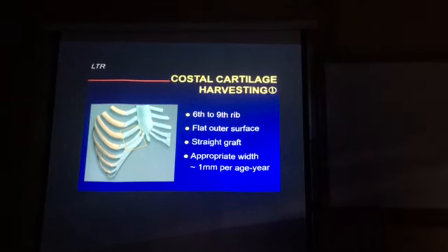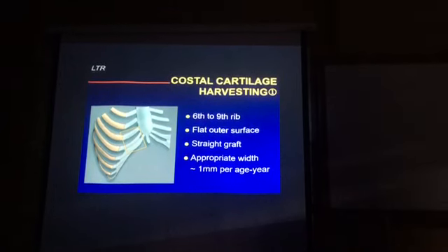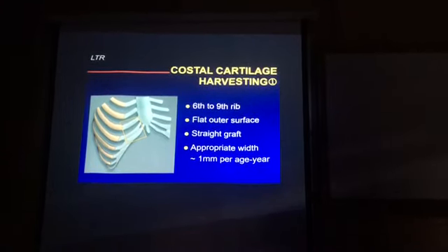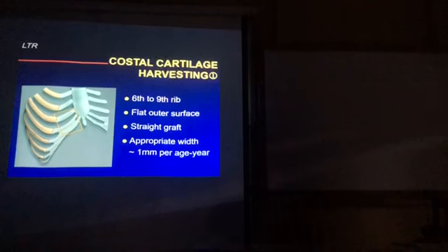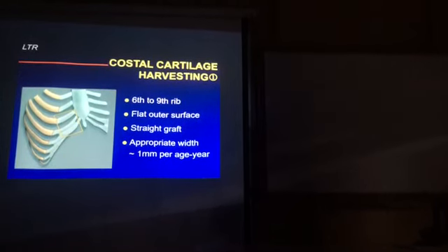So I mentioned about the fixation of the epiglottis. If I open from above, I have to fix the epiglottis too. He's talking about fixing the epiglottis that you open from going top down. Yeah, well, you transect the epiglottis, but then when you close your laryngofissure, you do a pexy of the epiglottis. I can show you how you do this.